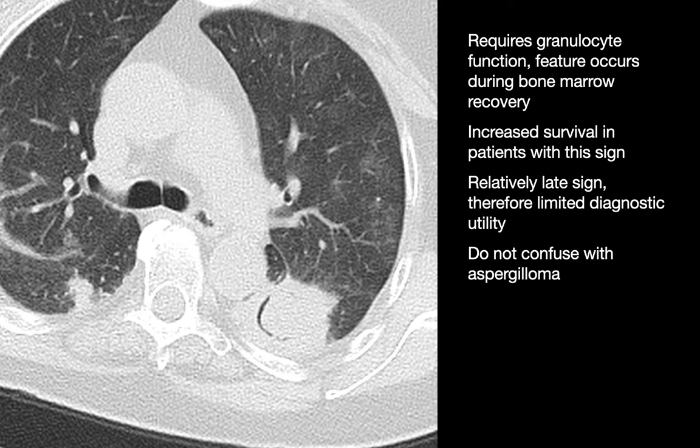Let's look at this one — identify this sign. On this image we see relatively geographic alternating regions with a lung print that looks a little blacker and then a little grayer. This is a mosaic attenuation pattern.